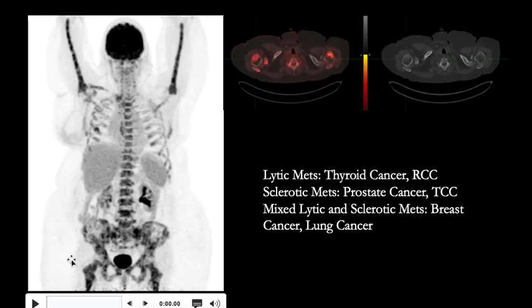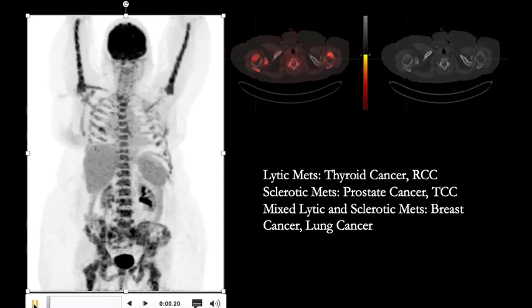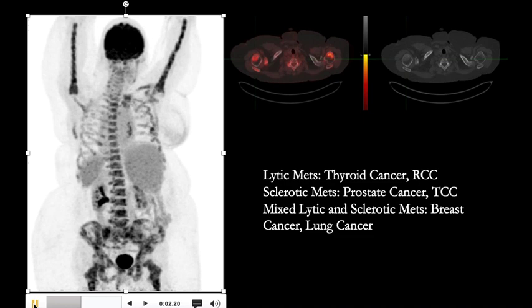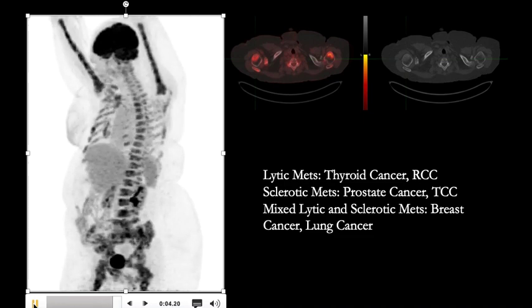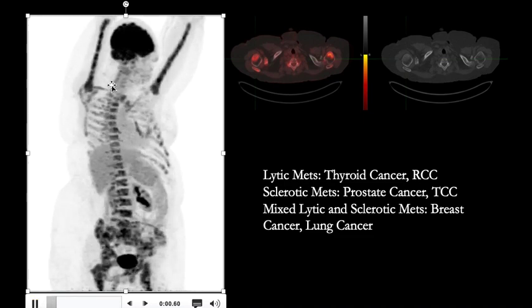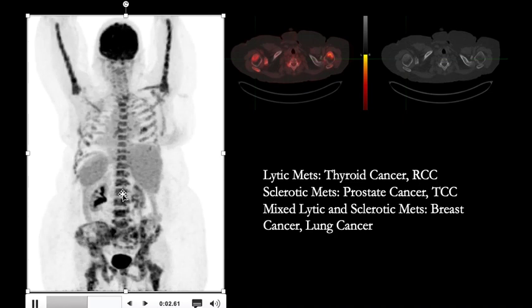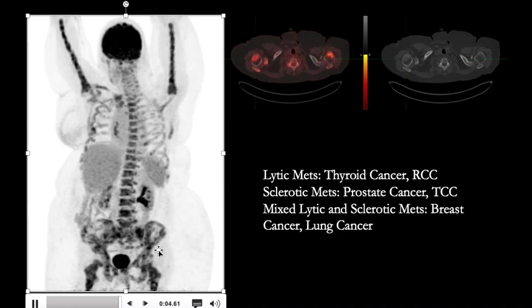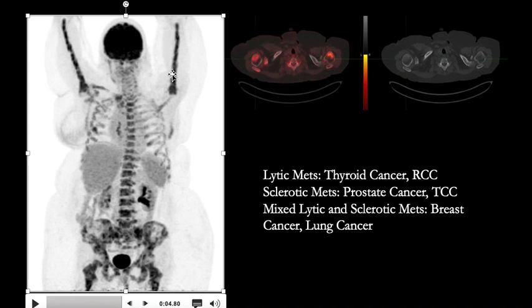Let's look at another case. This is a patient with history of breast cancer and we are looking at a whole body scan from this patient's FDG PET CT study. We see increased uptake in the axial skeleton and also involving the proximal aspect of the femur and the humerus. On the right we have a transaxial fused PET CT image and the CT in bone windows showing sclerotic foci that are hypermetabolic. This patient has extensive bone metastasis which are sclerotic in nature and hypermetabolic.